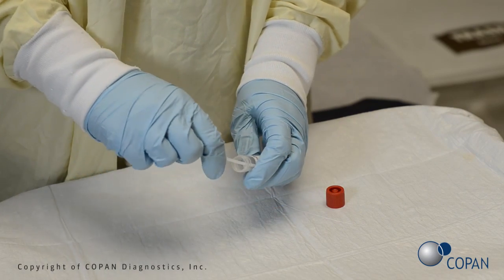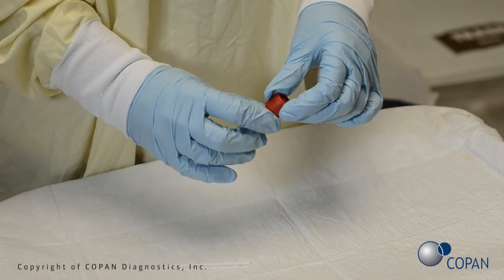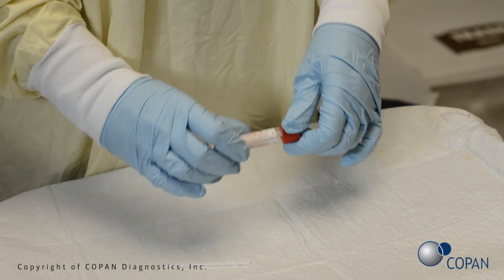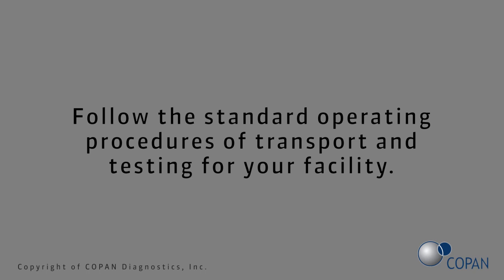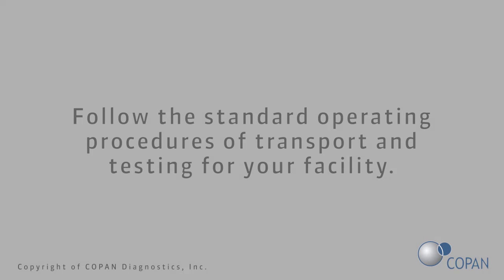If the specimen testing is not performed at the point of care, refer to the manufacturer's instructions for transport and storage recommendations. Follow the standard operating procedures of transport and testing for your facility.